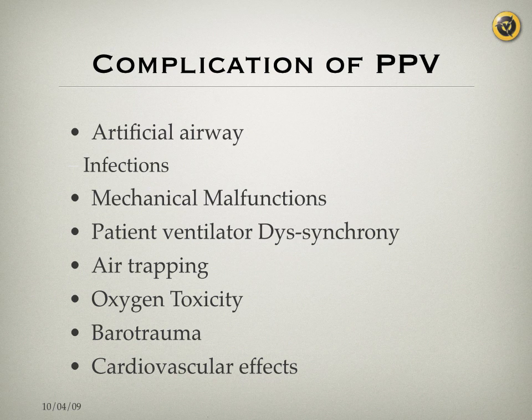And hence, you have two options here: either sedate the patient and control their ventilation yourself, or, if the patient is interactive and ready for weaning, you can choose a mode like pressure support or SIMV to allow the patient some freedom in breathing, and then let them breathe without sedation.